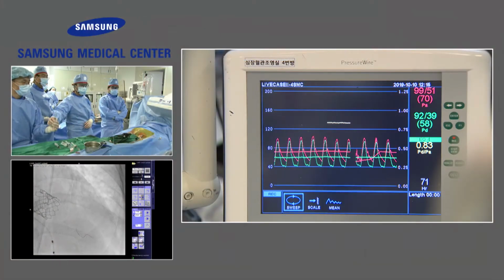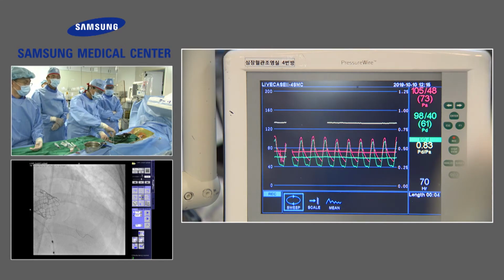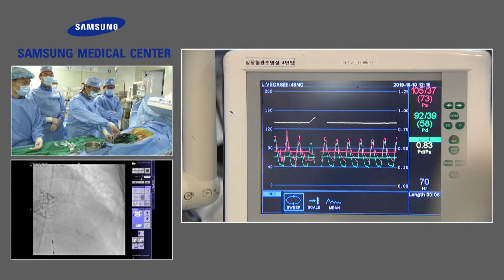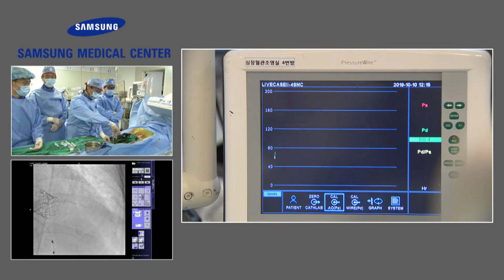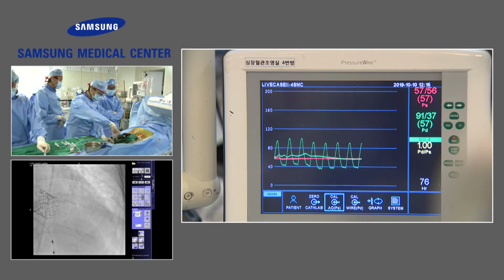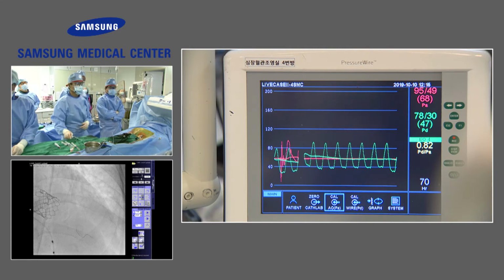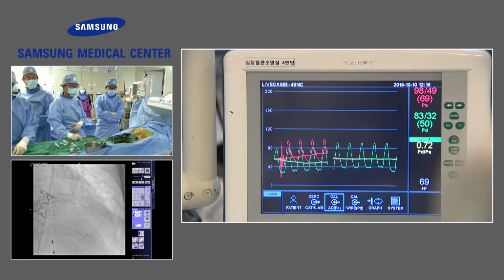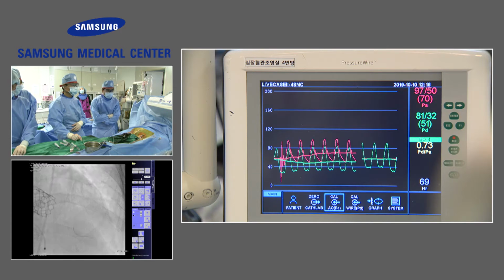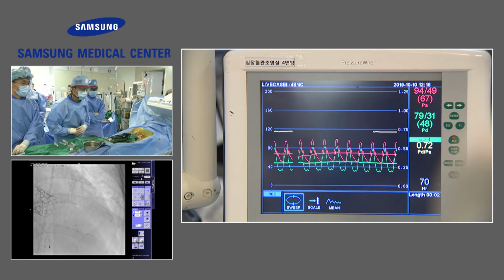Resting FFR is Nicorandil 0.8. We use intracoronary injection. It's published that the intracoronary Nicorandil is quite compatible with intravenous adenosine. So our routine practice is Nicorandil. Okay, we gave it. See the nip, getting lower. 7-1, 7-2.